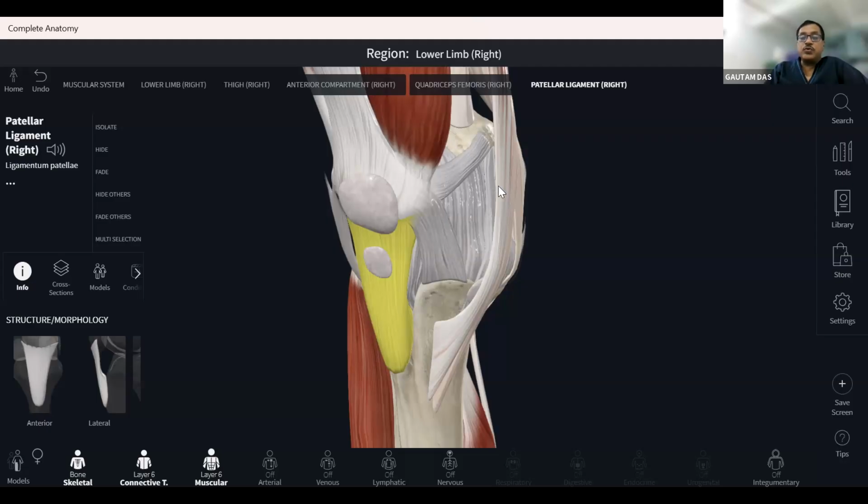will be there. So when we come to the medial side of the joint, we'll be able to see the three layers. The superficial-most layer, which is the patellar retinaculum, will be continuous with the vastus medialis muscle. And then we'll come to the patellofemoral ligament, which is intermingled with the superficial layer of the medial collateral ligament, and then the deeper layer of the medial collateral ligament.